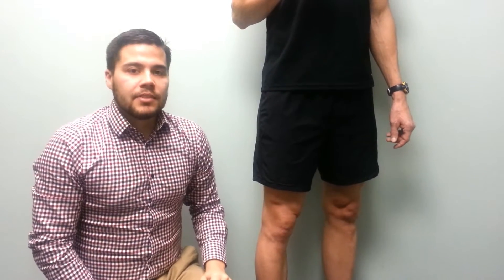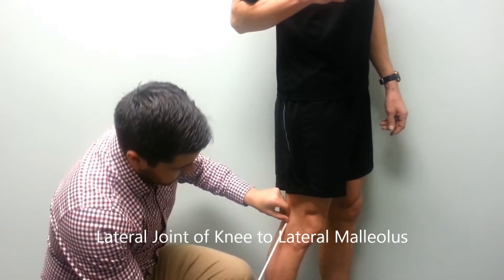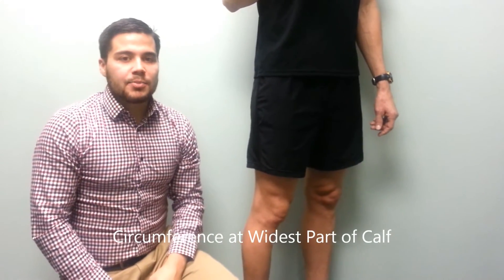Our next measurement is the length from the lateral joint of the knee to the lateral malleolus. Our next measurement is a circumference at the widest part of the calf.